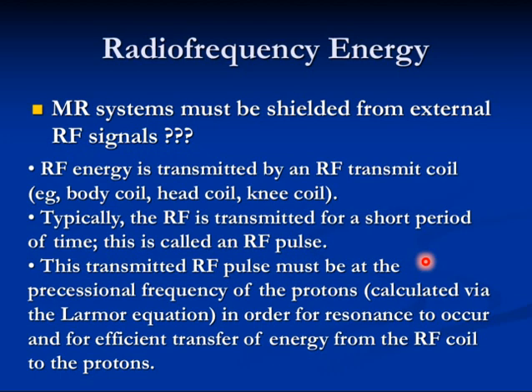So MR systems must be shielded from external radio frequency signals. Why? The MRI room must have no radio frequency signals ever inside it. Shielded, meaning when you go inside and close the door, your mobile will have zero signal. Your internet will stop. Anything that uses radio frequency will not receive signal. Why? Because we detect radio frequency waves. If there are external waves, they will be detected and will cause noise in the image, a bad image. If you leave the door open, radio waves will go in from everywhere, and you'll have in the image, for example, Michael Jackson, or whatever was on the radio at that time. You'll have noise.